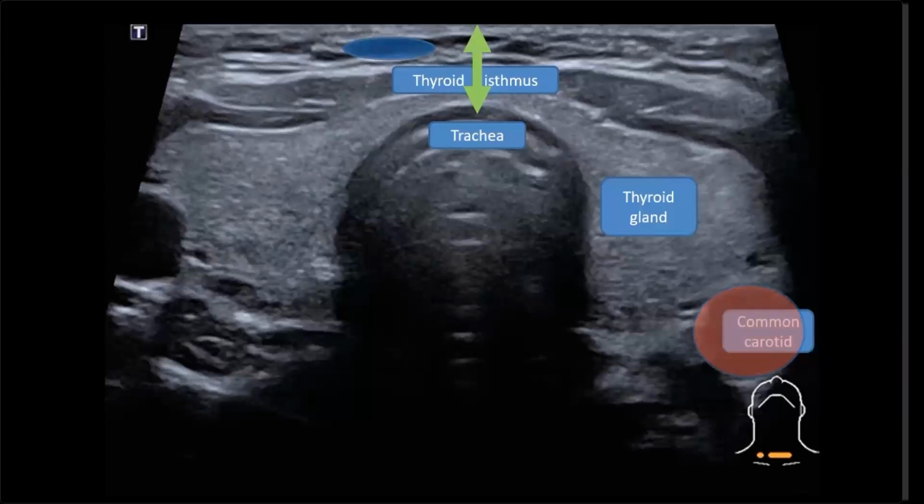So, for example, the carotid artery is something you definitely want to avoid. And arteries are typically pulsatile, and you cannot compress them when you squash the tissues with the ultrasound probe. That's in contrast to veins, which are compressible, but they still can get in the way. So there can be anterior veins right over where you want to make your incision, but veins off to the side are usually ones that you can avoid.